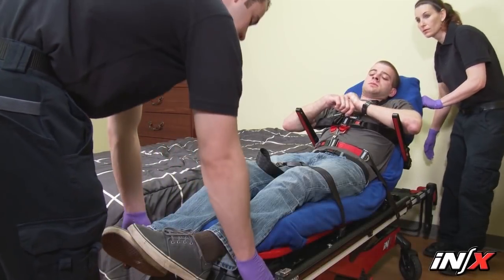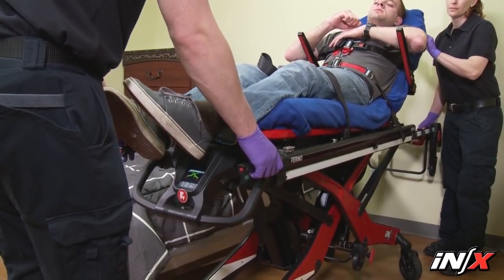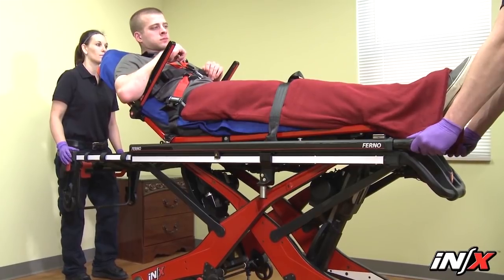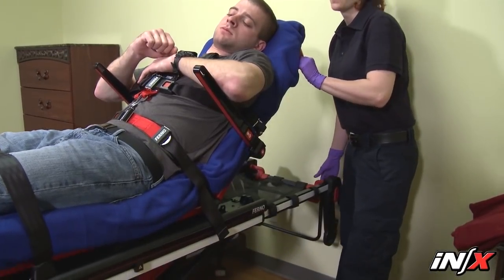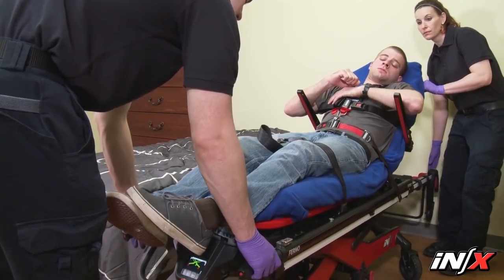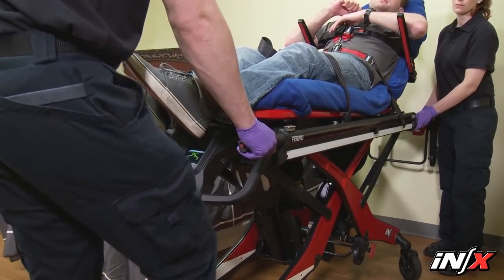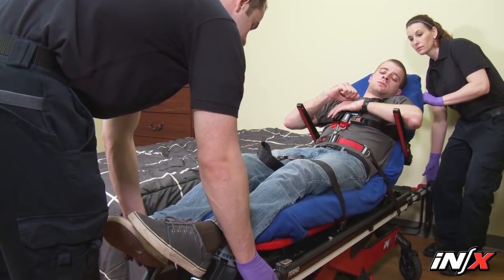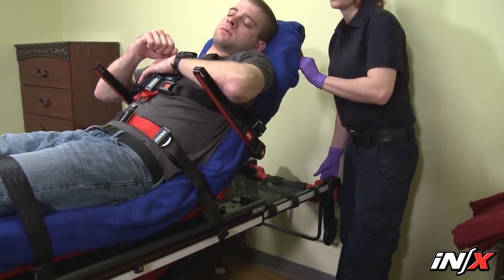Raising or lowering with a patient on the NX requires a minimum of two trained operators who are communicating, working together, and maintaining control of the NX at all times. Keep both hands on the NX mainframe. Maintain control so the NX doesn't shift during raising or lowering, but don't lift. Allow the NX to do the work. Press the plus extend button to extend the legs and raise the NX, or the minus retract button to retract the legs and lower the NX until it reaches the desired height. During the position change, move with the NX and maintain your grasp on the mainframe. Again, don't lift. Allow the NX to do the work.